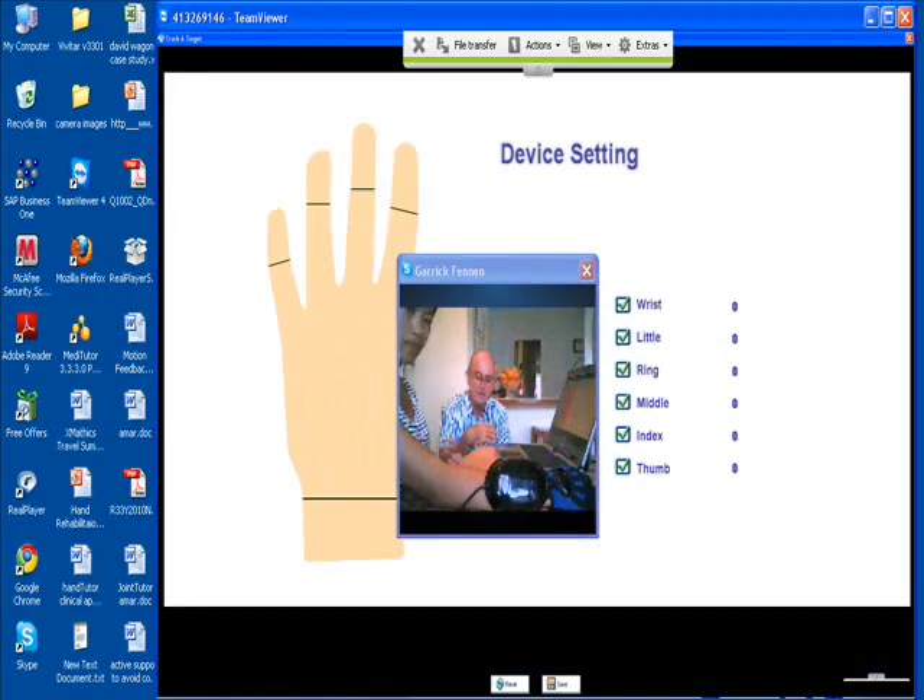I would suggest you should start off with the fingers, then go to the wrist, and then the thumb — so fingers, thumb, and then the wrist. Okay, isolated.